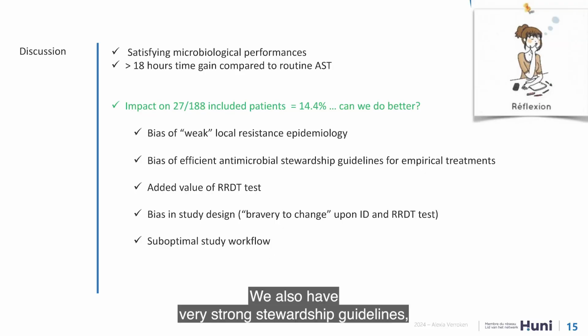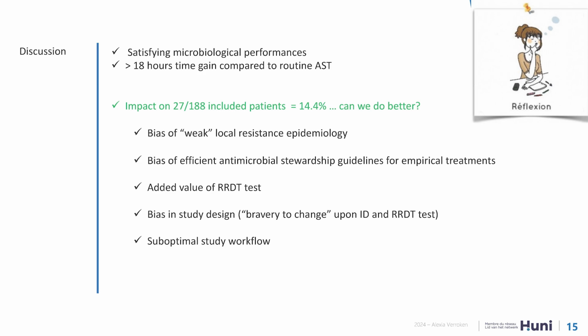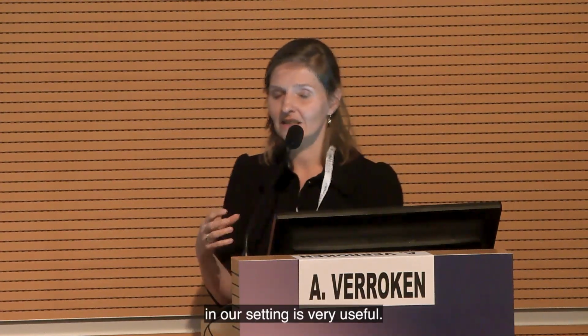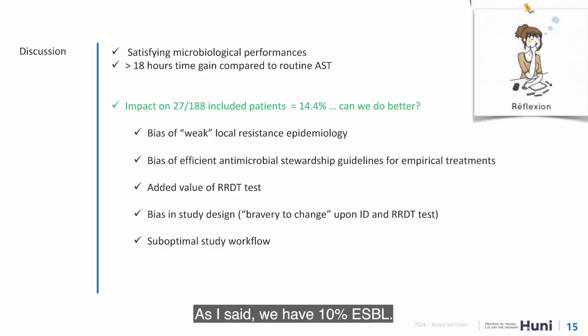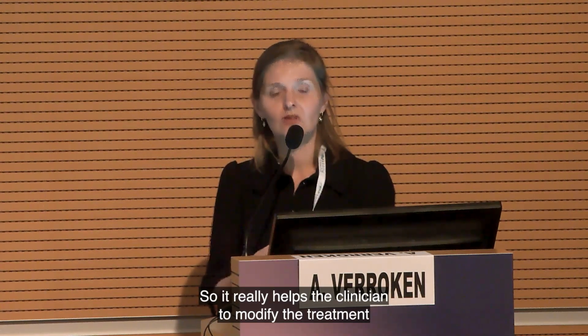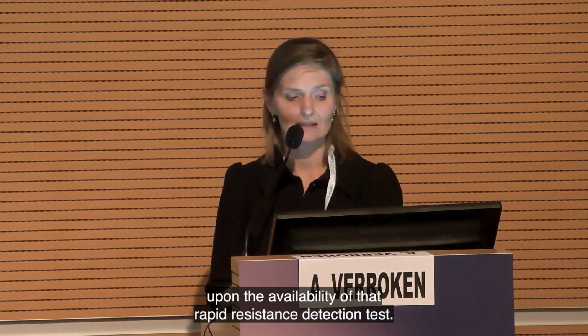We also have very strong stewardship guidelines, which really helped in the selection of the appropriate empirical treatment. I also believe that the rapid resistance detection test in our setting is very useful. As I said, we have 10% ESBL. That's our main resistance in Enterobacterales. So it really helps the clinician to modify the treatment upon the availability of that rapid resistance detection test.